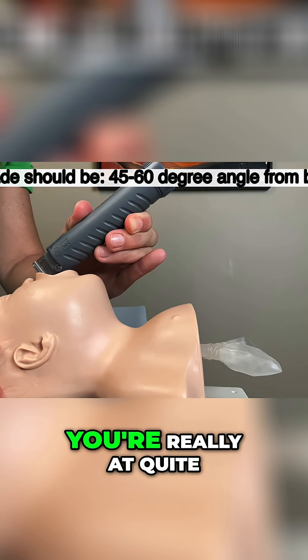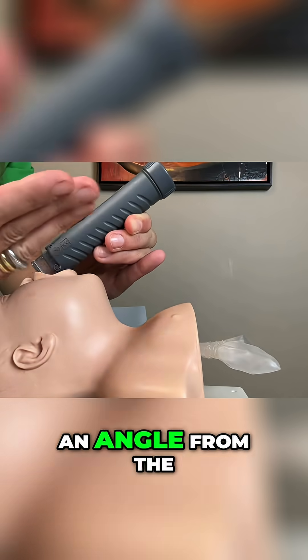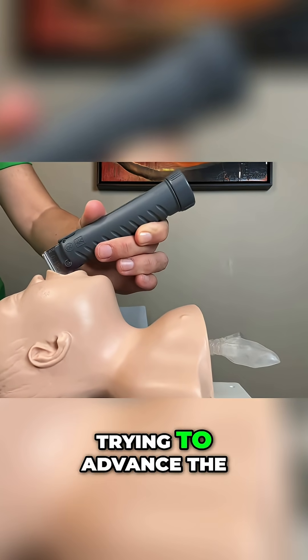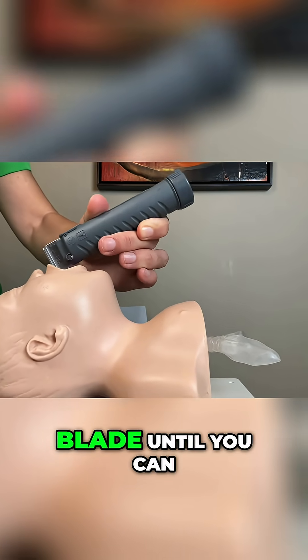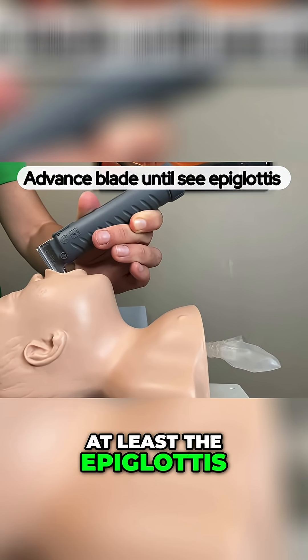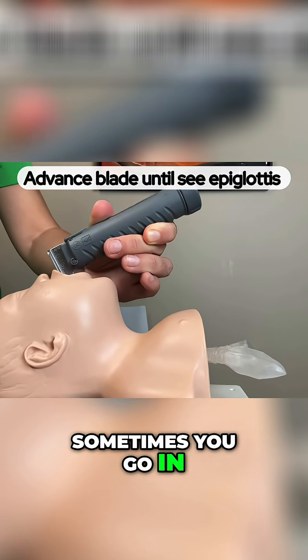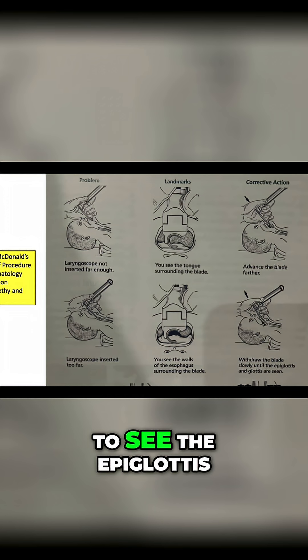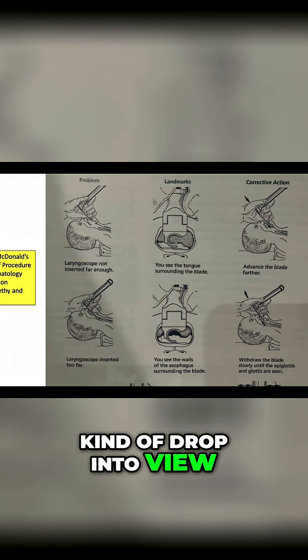At this point you're trying to advance the blade until you can see the vallecula, or at least the epiglottis. Sometimes you go in too far and you have to pull back a bit to see the epiglottis drop into view.